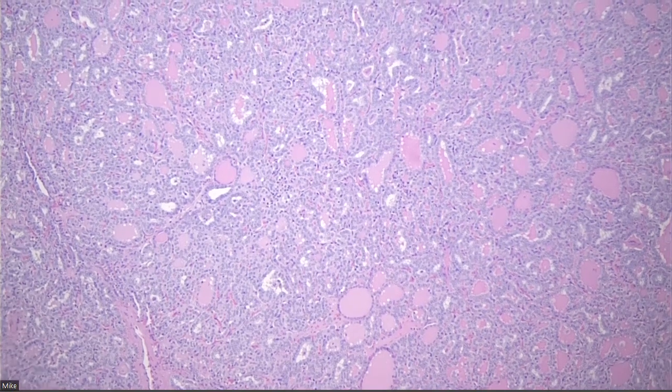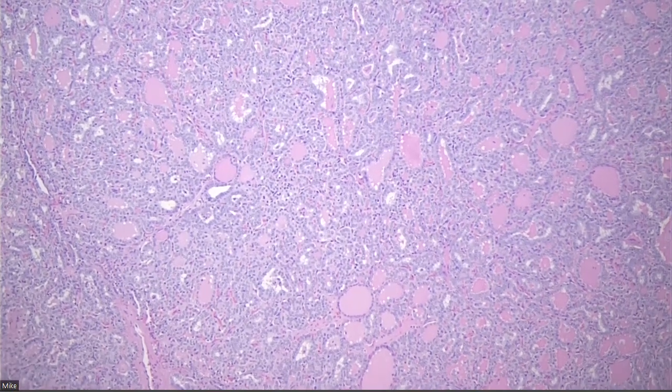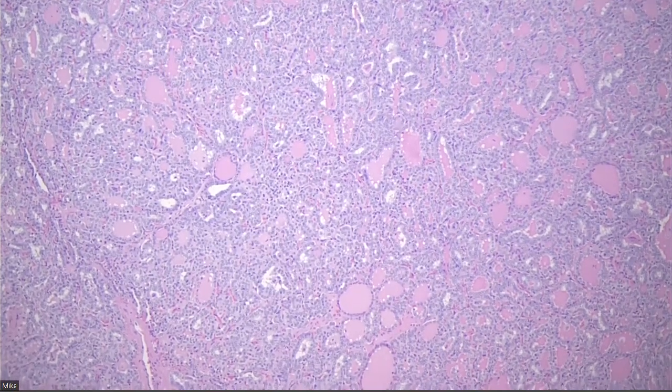Should you be suspicious? I feel like when I looked at literature, which is probably old, if papillae are present, that basically buys you a diagnosis of PTC. So in this case you had papillae, but you were still skeptical that it was a PTC. Yes. So when should you be skeptical?